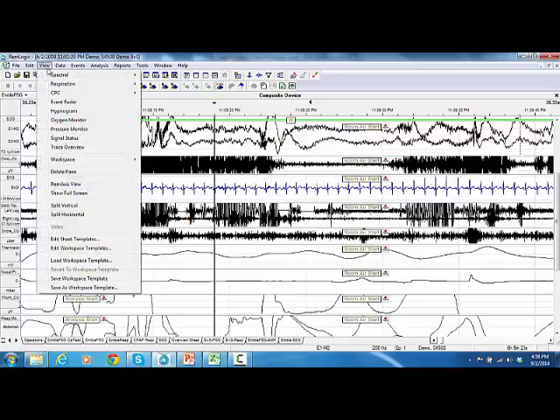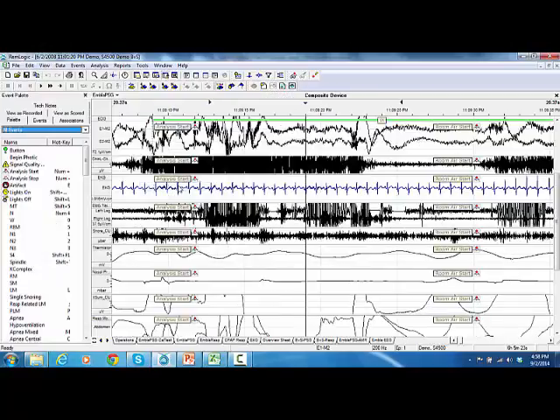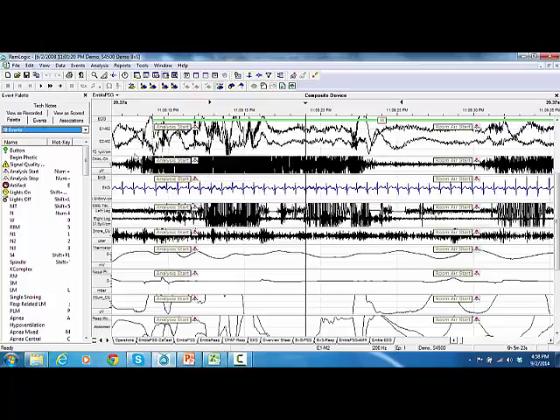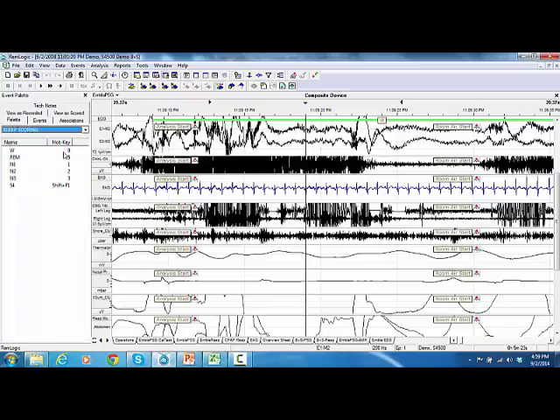To stage the sleep epochs, go to View Workspace and select Event Palette. From the palette menu, select the Sleep Scoring palette to display the associated hotkeys. Then change the time base of the work pad to 30 seconds by clicking on the right or left top corner of the work pad.